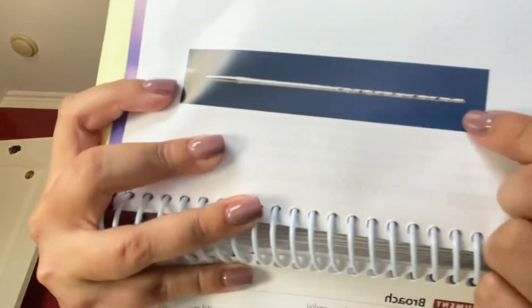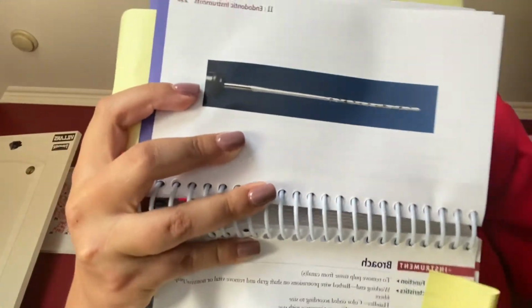lubricate the canals. And then if necessary, we're going to use a barbed broach. This is used to get out the necrotic pulp and stuff from the canal. It looks like this. It almost looks like barbed wire, around. These are little sharp, kind of like sharp fish hooks. It just helps remove the necrotic pulp. Most of the time the pulp will come out in pieces. It won't come out as the full pulp.